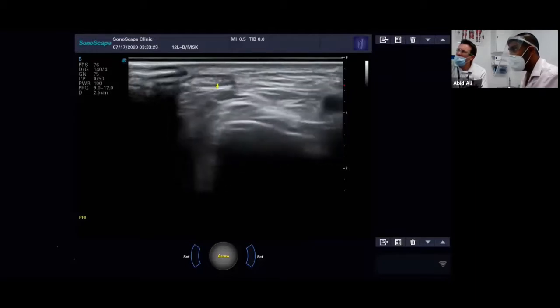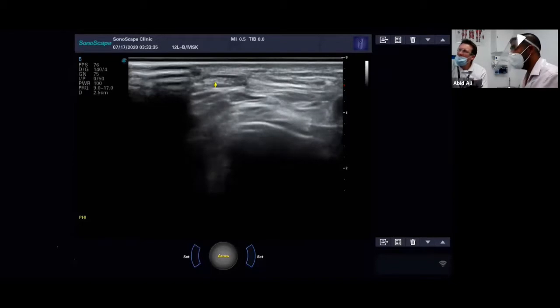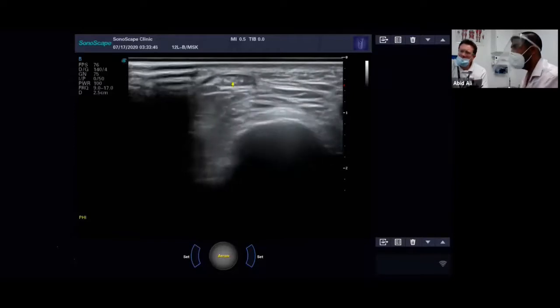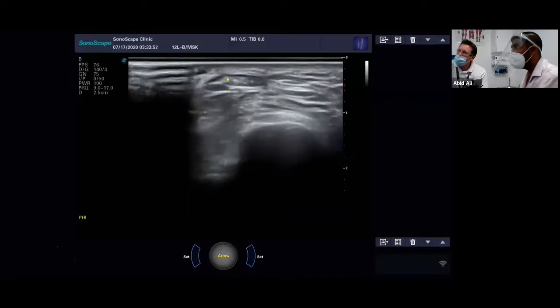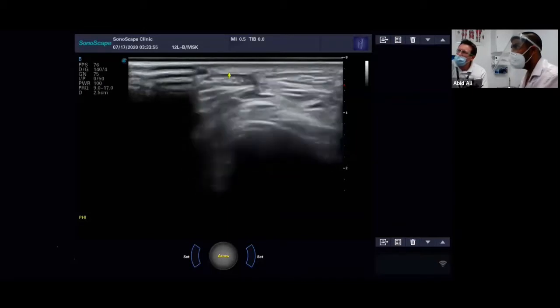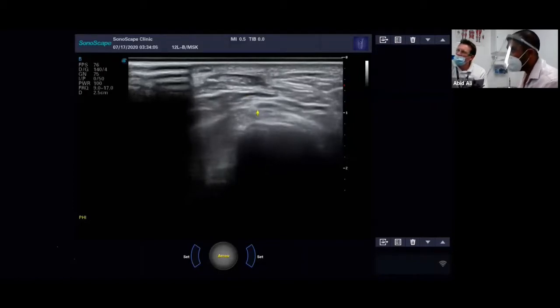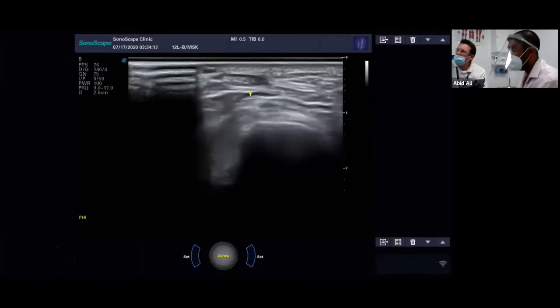We're looking at the internal fibre. Often if you have a tear, it'll be kind of a C shape, isn't it, Adrian? Yeah. You can get more linear ones as well, but often there's a sort of C shape to it for some reason. They all kind of appear the same. Yeah, a little defect in the actual tendon, but also you can look for obviously tendinosis and synovitis. You just have fluid around the tendon. And that would appear as like a black halo. Yeah. Which is a kind of a little bit of what you can see there, but of course a little bit of a halo is normal. You should always have a tiny trace amount of fluid in your paratenon, and anything more dark or black than that could indicate something pathological.